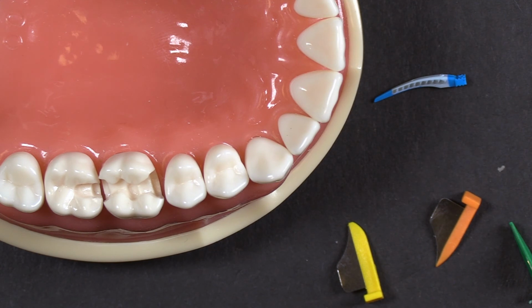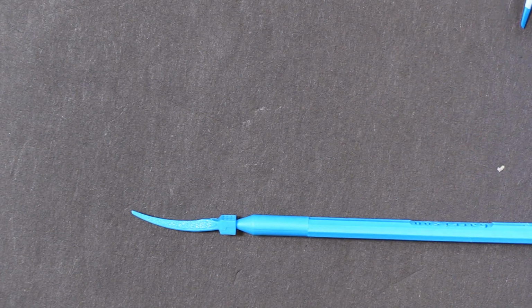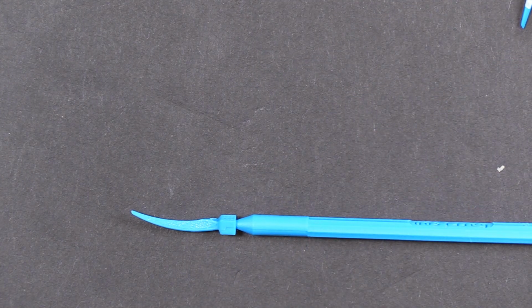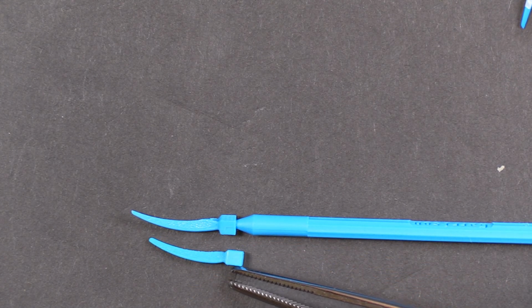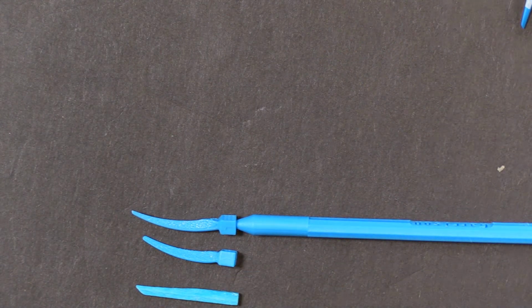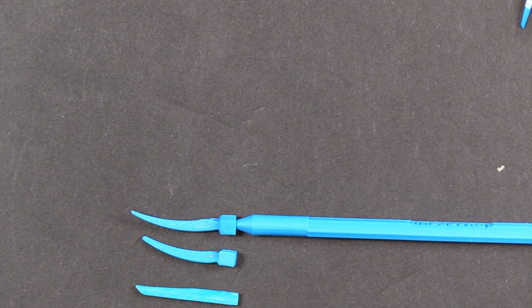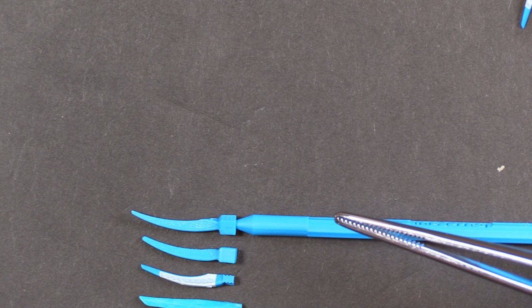Sometimes wedges seem like they're too short. Well, big wide molar, and maybe the wedge isn't quite long enough to go all the way through the interproximal space. Well, the wedges are a little different. Like I've got blue ones here from a couple of our different systems. Let's see, I've got a fusion wedge right here. Okay, our longest wedge is the wedge wands, the ones with the handle on them.